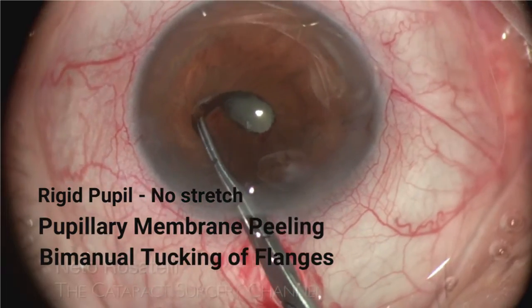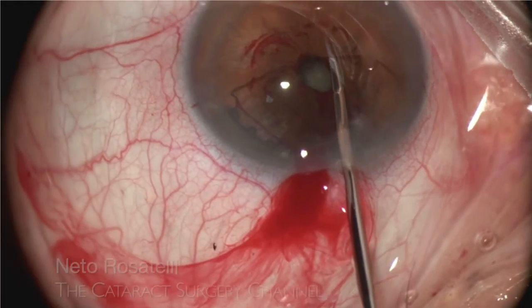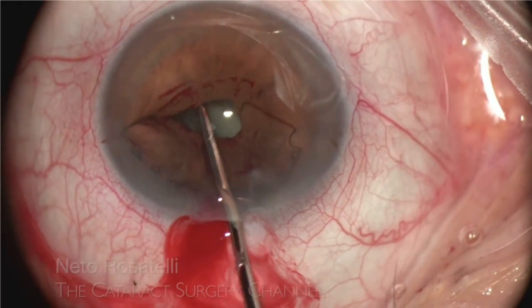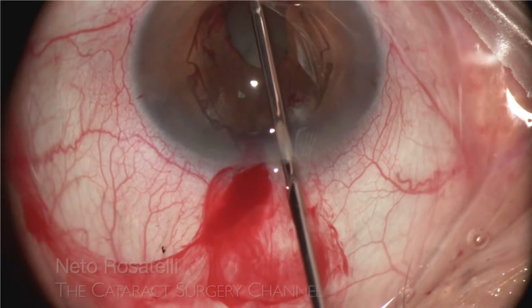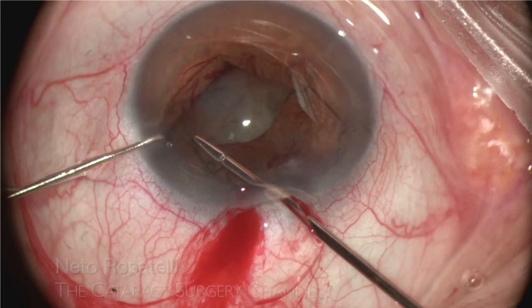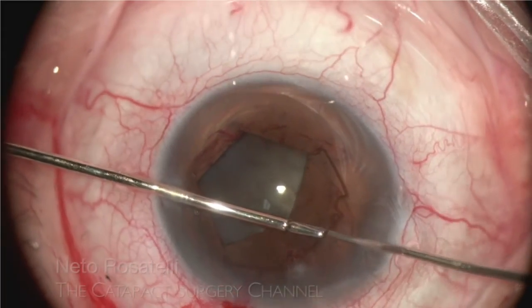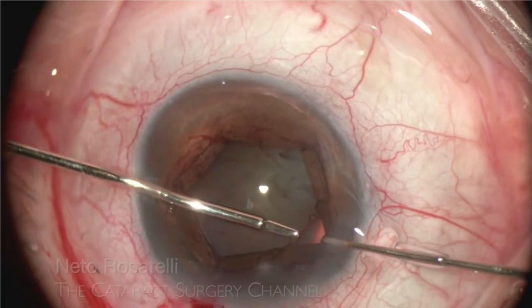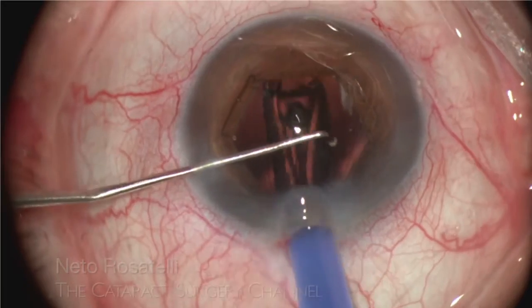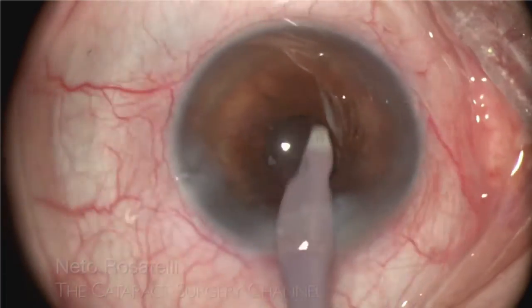This is a rigid pupil with a fibrotic membrane. Stretching was not attempted and only the fibrotic membrane was removed. When the pupil still remains rigid, bimanual tucking of the flanges using the forceps and the iris hook or Kuglin hook helps engage the BHEX with ease. We have such good visibility for surgery, and despite being rigid and fibrotic, we have a nice round pupil.